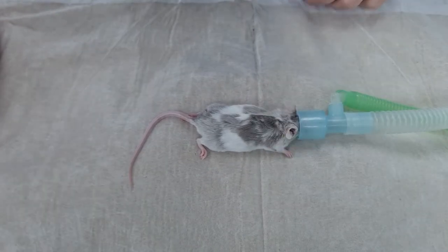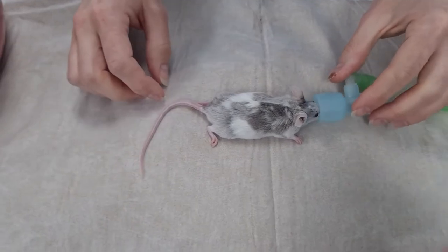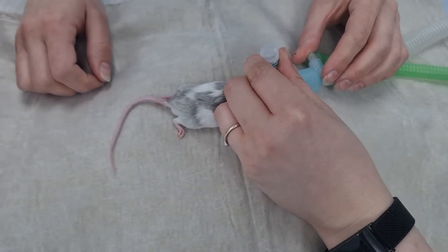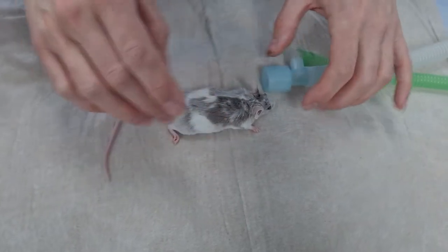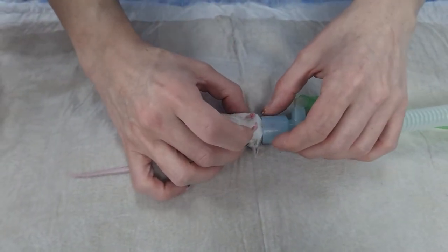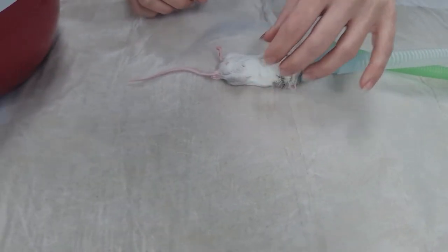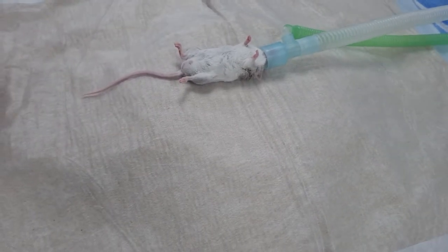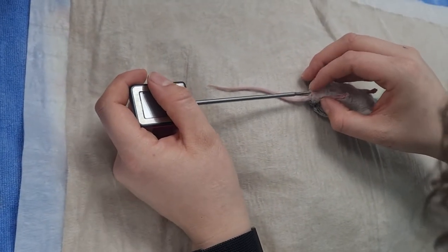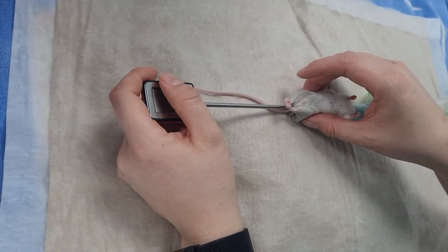Our biggest things to be aware of with anaesthetics with these guys: one is that they are very, very prone to alpha-2 related cataracts, so we use a lot of lubrication — they do go away, but it's a bit scary the first time you see it. The other thing is that they are very small, so they are very good at getting cold. We do a lot to keep track of their temperature, usually using a rectal probe thermometer, monitoring pre-, peri-, and post-op.